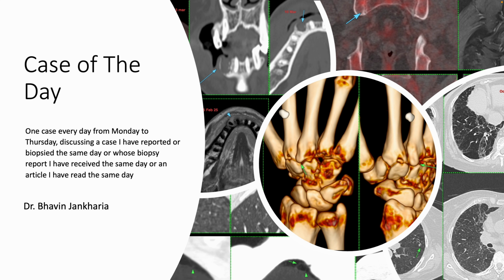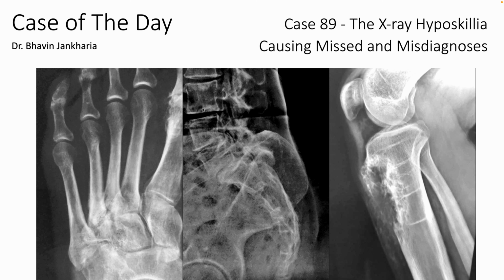Hi, today is the Wednesday edition of Case of the Day. We're on our 89th case, and the title is The X-ray Hyposkillia Causing Missed and Misdiagnosis.